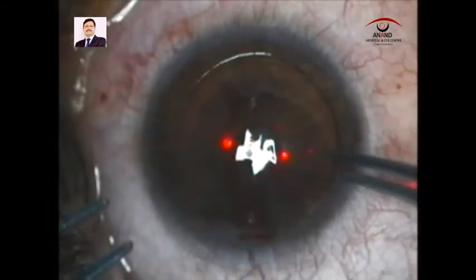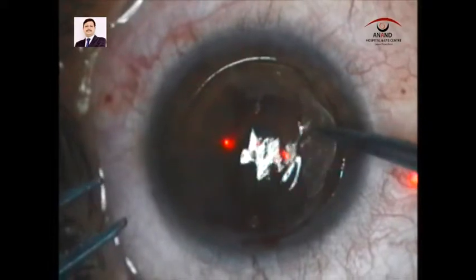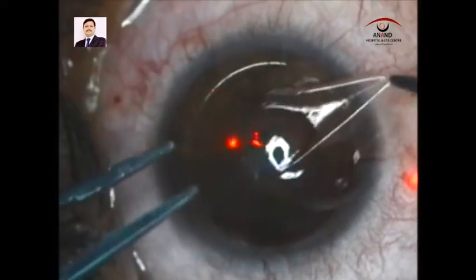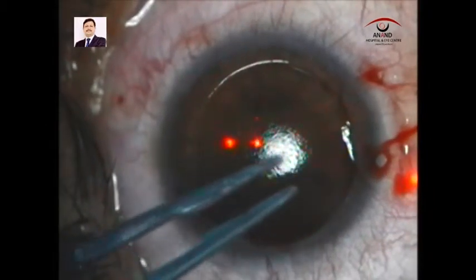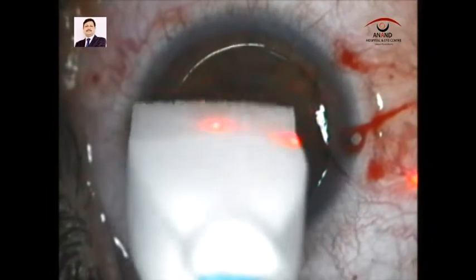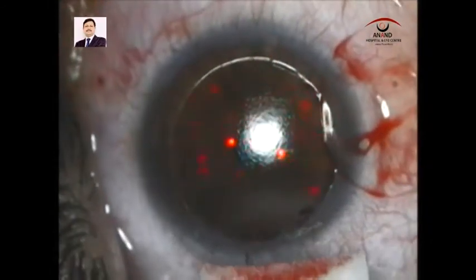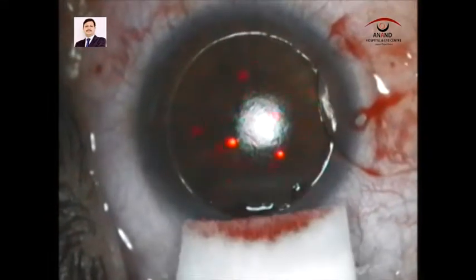Once the blood is removed, we take the flap and proceed with the excimer ablation. We keep the flap in such a way that the flap position is not missed. The bed is cleaned and we continue with the excimer ablation, which you can see being performed here.